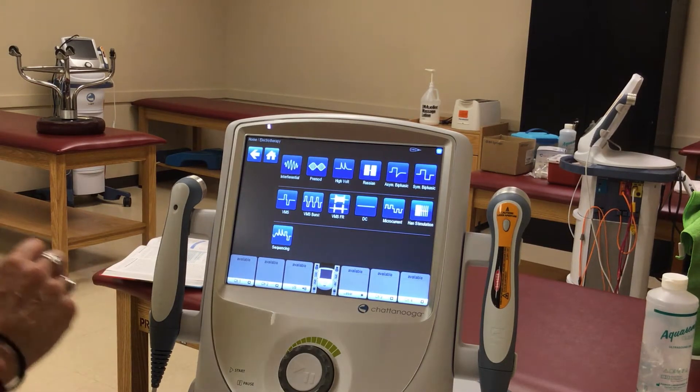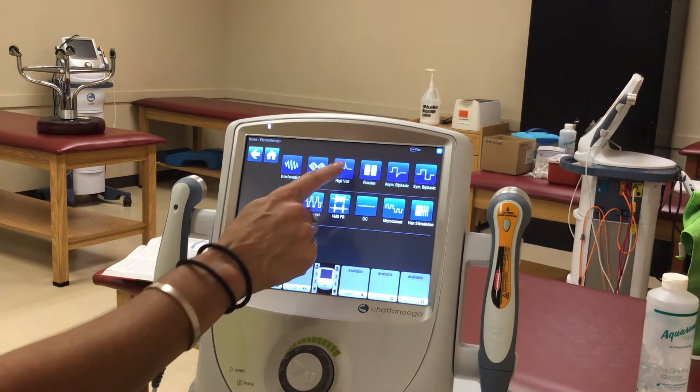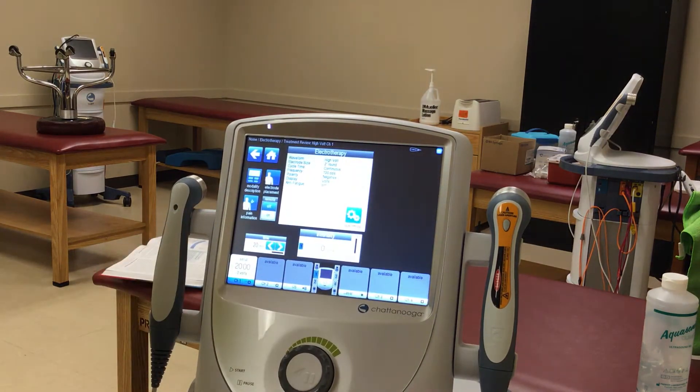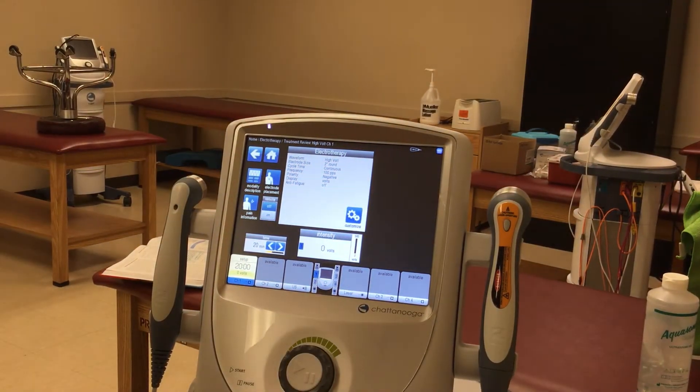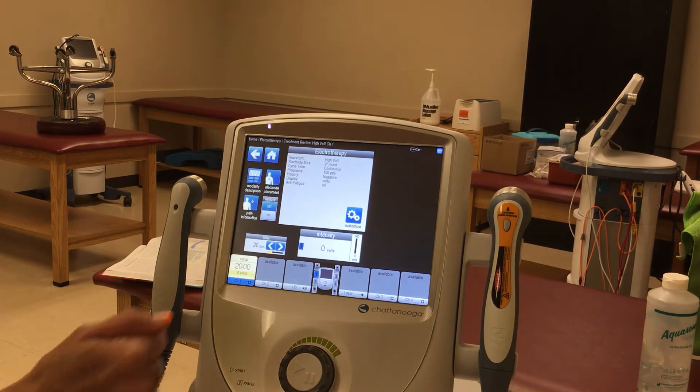High Volt is another electrical therapy that we can do, and it is best used for wound healing. There's some conflicting evidence about edema reduction, and so far it hasn't really been shown. So primarily in this class we'll mostly use it for wound therapy and wound care.